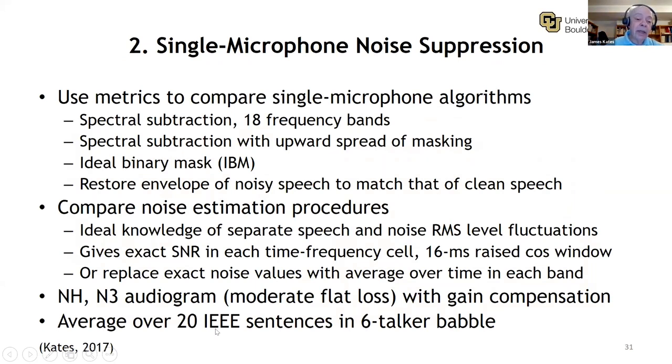I took a look at noise suppression algorithms a few years ago, and I compared several different single microphone noise suppression algorithms: spectral subtraction that incorporated an upward spread of masking term, ideal binary mask, and restoring the envelope of the noisy speech to exactly match the envelope of the clean speech.